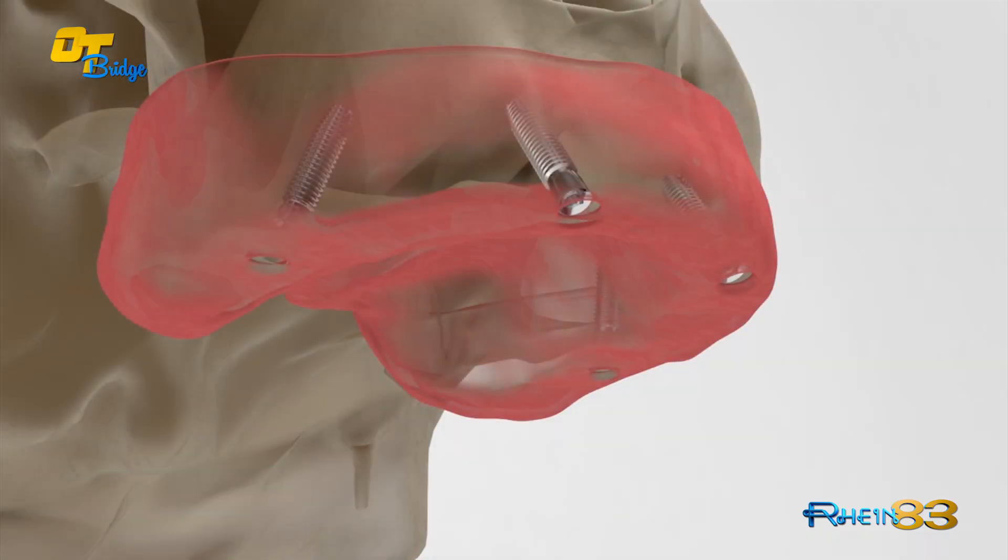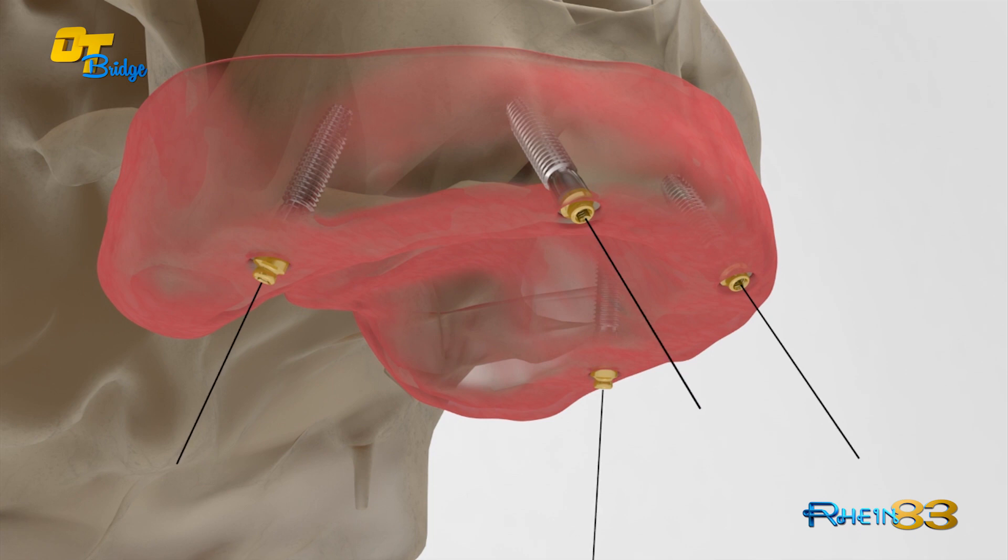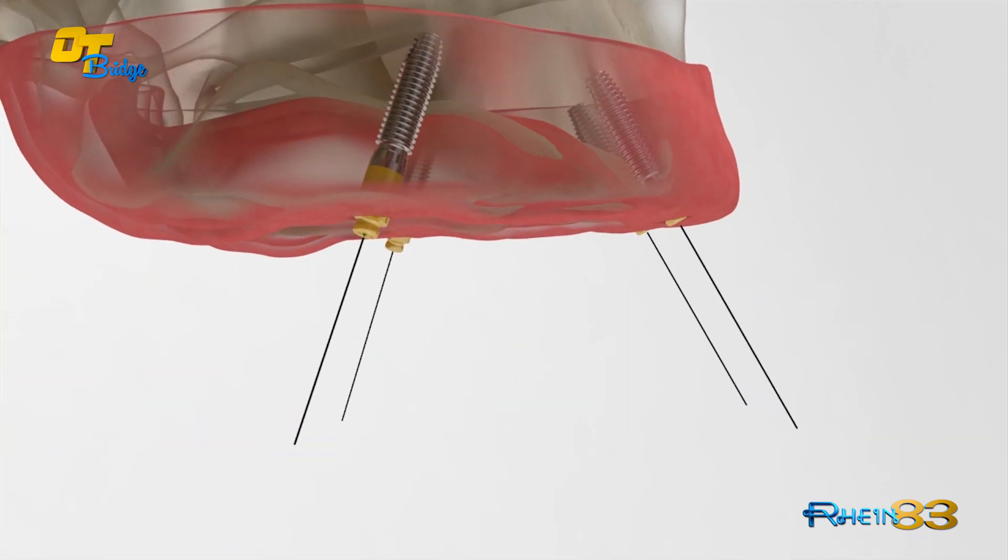Screw the OT Equator on the implant with the correct torque. In the anterior region, the OT Equator can be shorter and positioned lower than the ridge, concealing the abutment and achieving better aesthetic results.